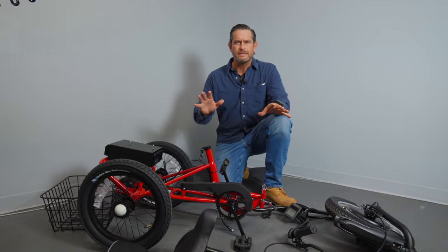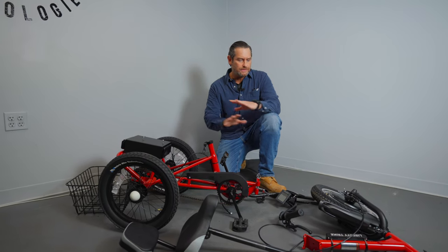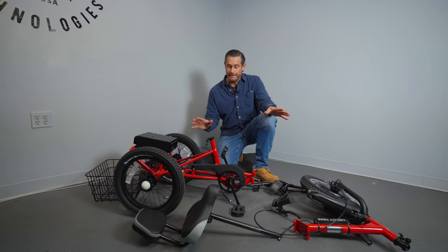The hardest thing about unboxing and assembly of a Liberty Trike is going to be taking all that packaging off of all the parts. Now that we have all the parts laid out, I'm going to show you how to put this together.